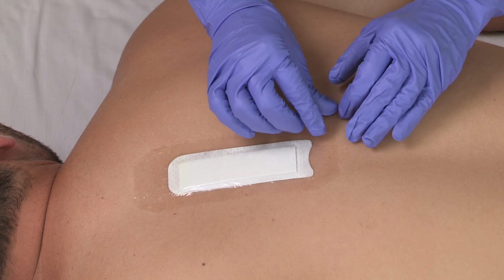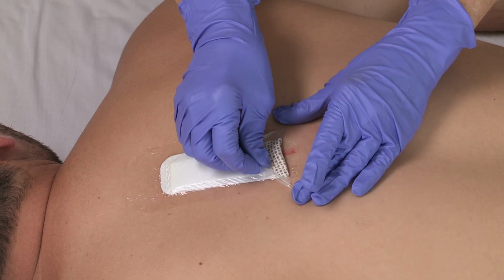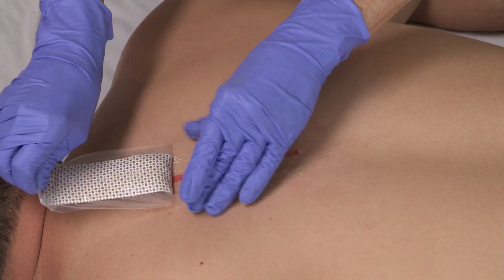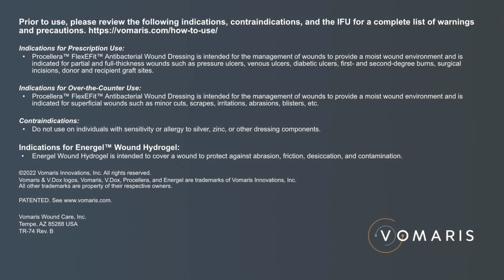To remove Procellera FlexEFit, lift one corner of the adhesive layer and gently pull back, keeping the adhesive low and parallel to the skin surface. If the dressing adheres to the wound surface, moisten it with sterile saline or water until it can be removed without tissue disruption. Prior to use, please review the following indications, contraindications, and the instructions for use for a complete list of warnings and precautions.